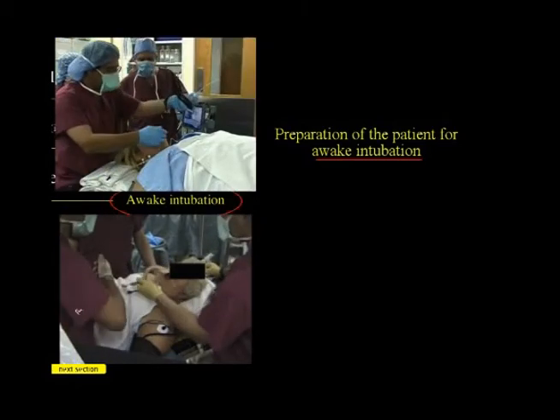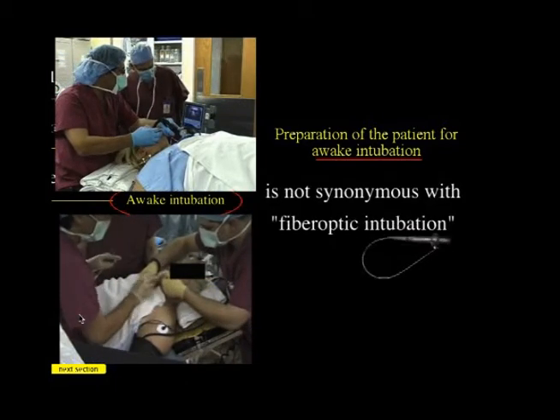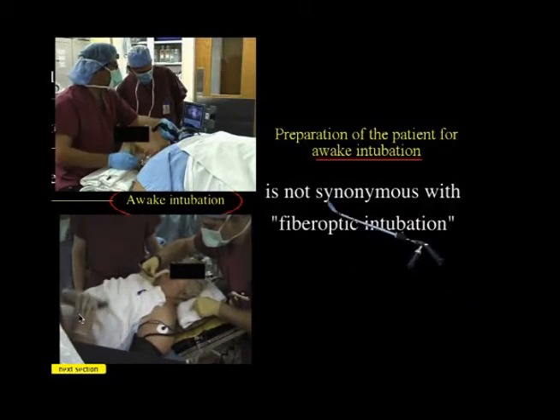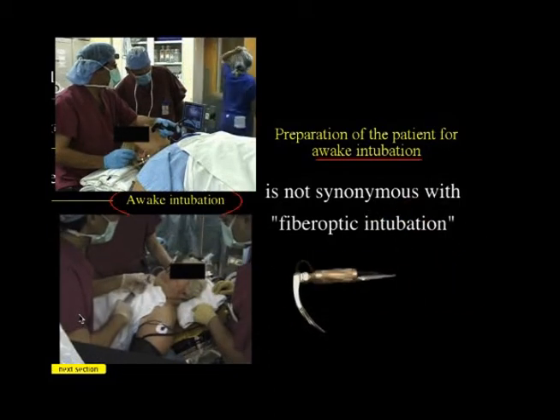We're not talking about fiber optic intubation, flexible fiber optic intubation. The flexible fibroscope is one tool that we can use. But any one of the tools that you can use with a patient asleep, you can also use with the patient awake. Okay? It's not limited to just a flexible fibroscope.